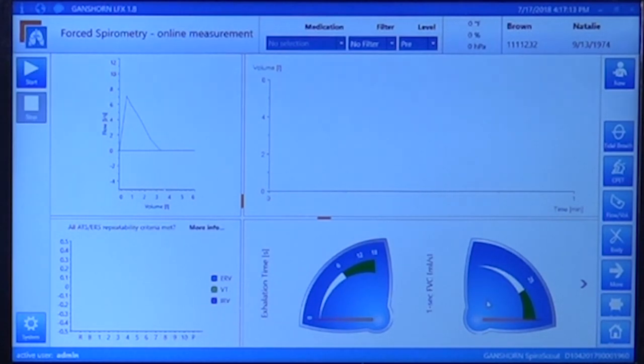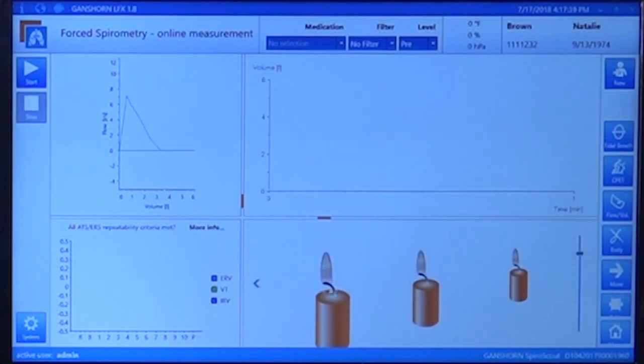If you have a pediatric patient, using the speedometer screens can be complicated. Just click on the arrow and you will have three candles that the patient can blow at any moment. If the patient has a pathology that lowers their peak expiratory flow, you can lower the relative effort required to blow out the candles. This does not change any spirometry parameters — it simply reduces the required effort so we avoid the child becoming frustrated because they cannot blow the candles.